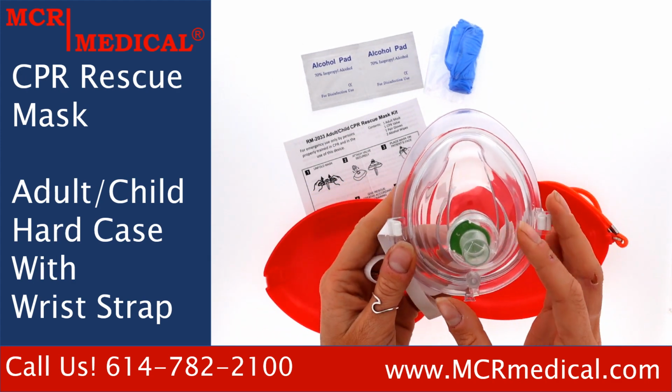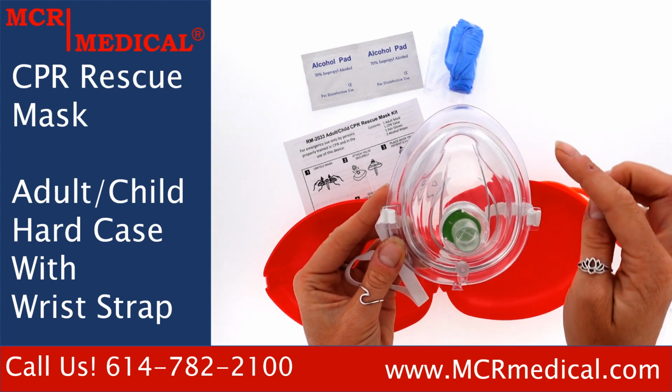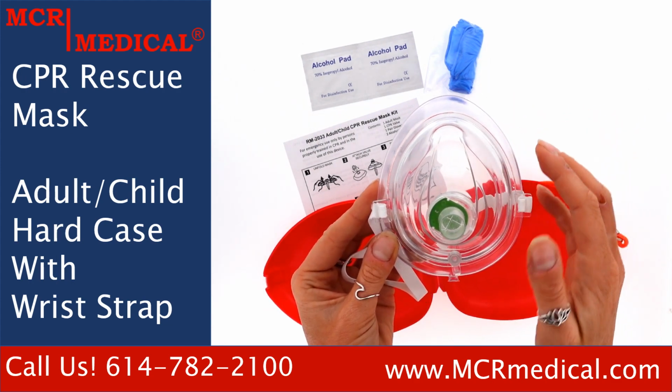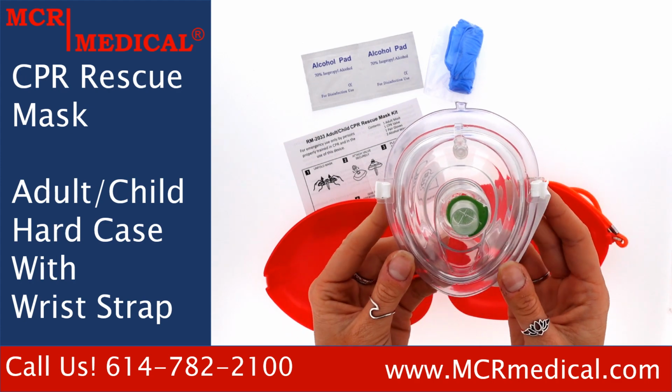To use the mask on an adult, you will want the larger part of the mask to be on the bottom, while the narrow part of the mask will fit around the nose. To use the mask on a child, simply flip the mask so that the narrow part is over the chin of the child.